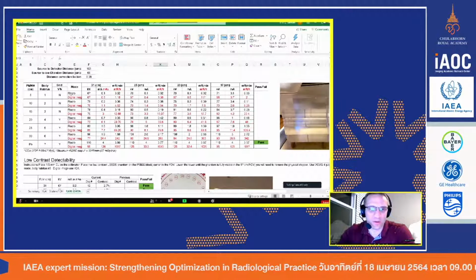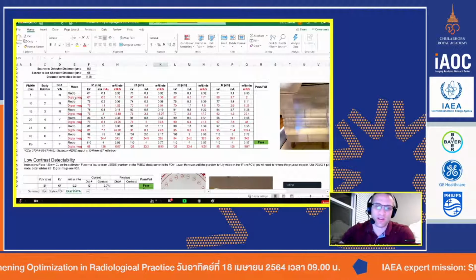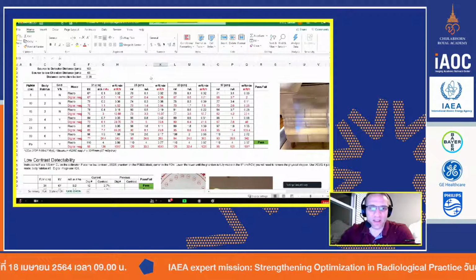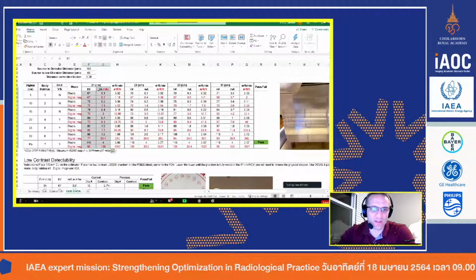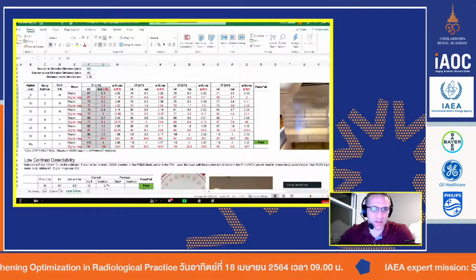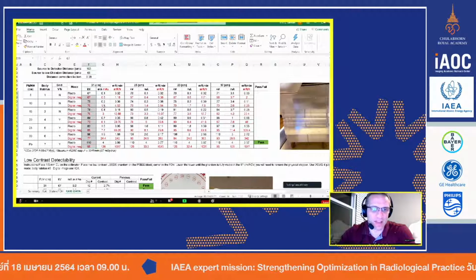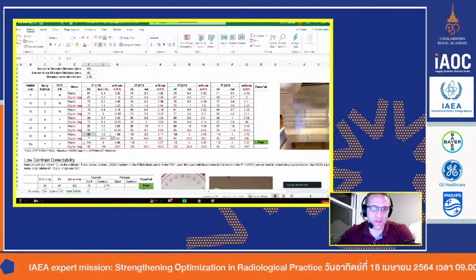And then I check the fluoro system, so just fluoro, and then I look at the digital image. So you have the acquisition image or the fluoro spot image, and then just the regular fluoro. You can see how it changes. I write down the kV values and the mA values, and I check them with time, every year, to make sure they're all the same. You can see as this system goes from thinner to thicker, the kV ramps up pretty quickly, and the mA doesn't change as aggressively. It does go higher, but this system really adjusts the kV.